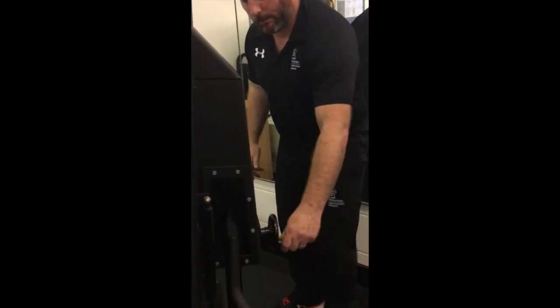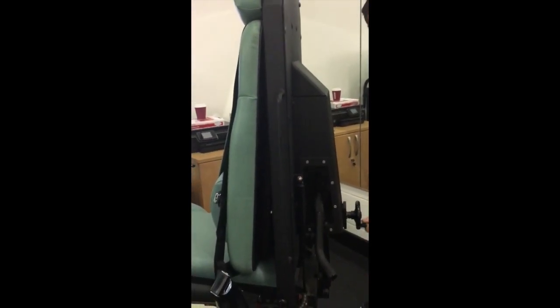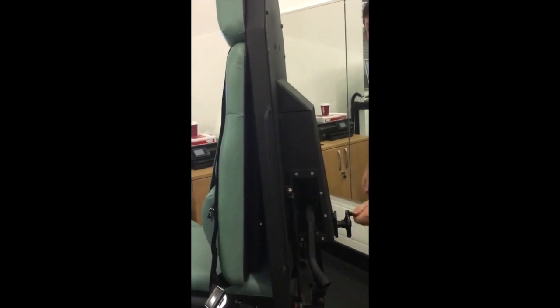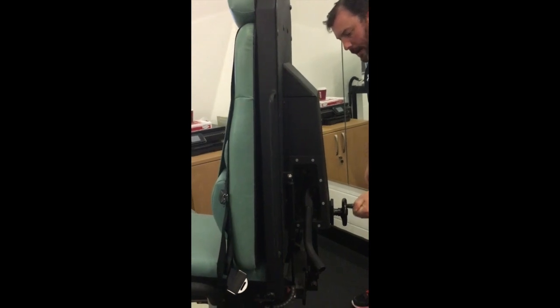And then there is this back translation, which is this one. You can see how that moves it forward. So that might be one that you change depending on the limb length of your person. We'll take that all the way back for now.